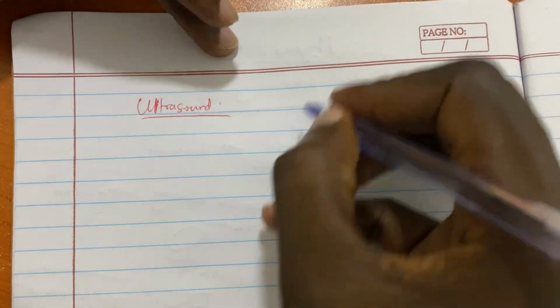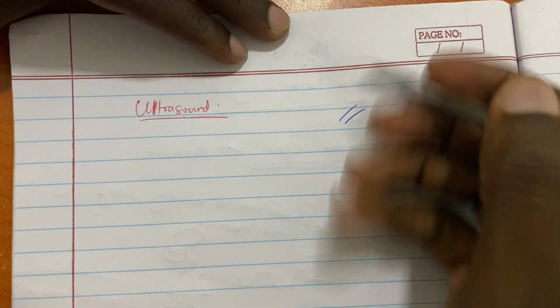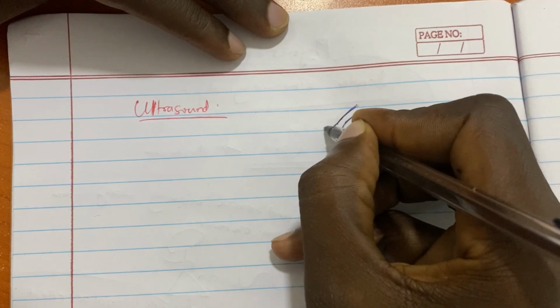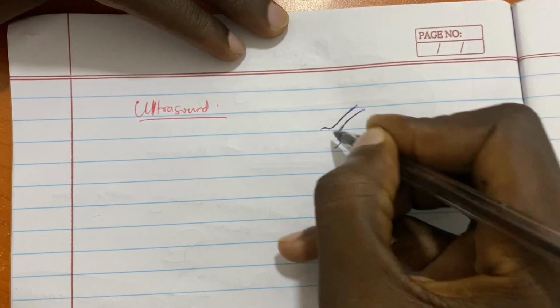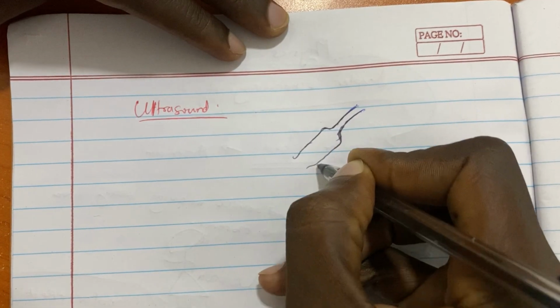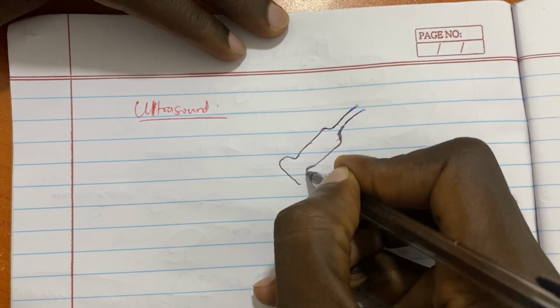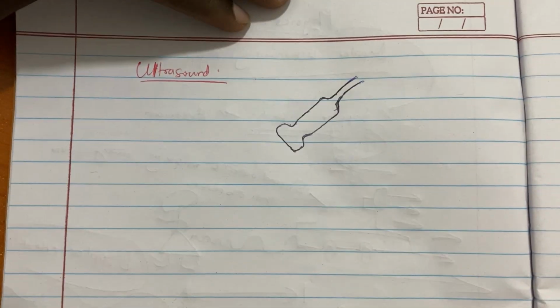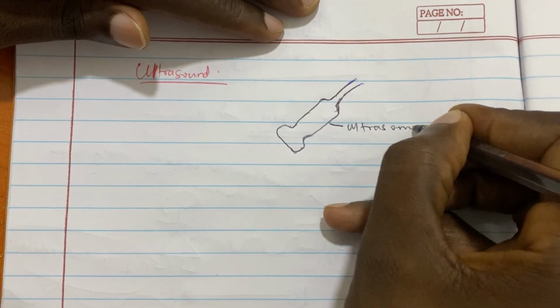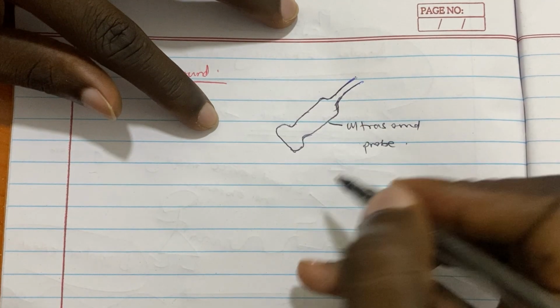In ultrasound, again, we have a probe. The ultrasound probe is the source of ultrasound.